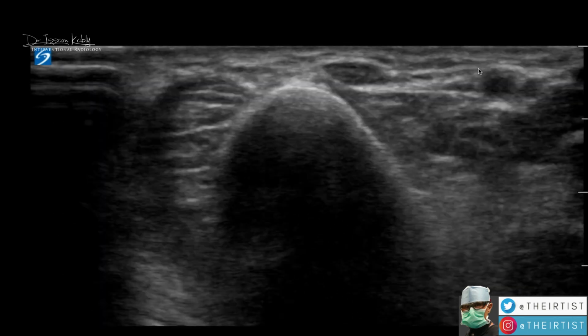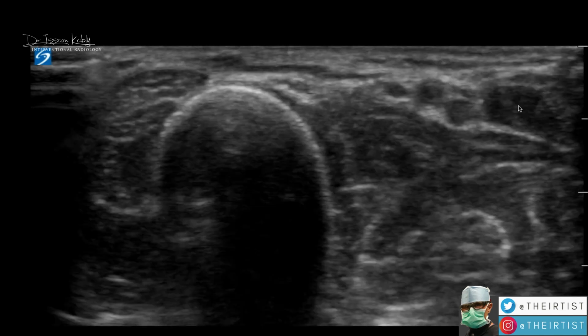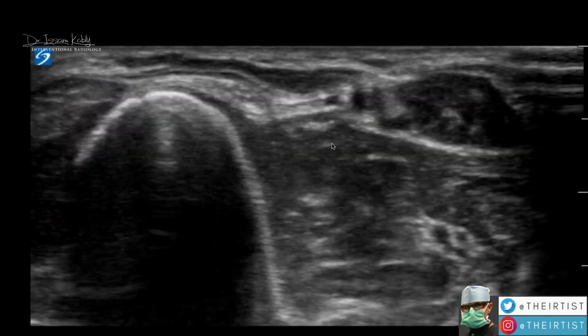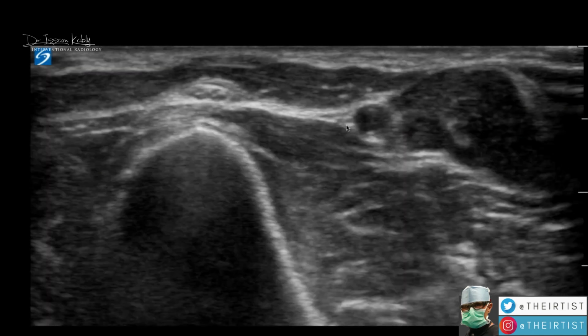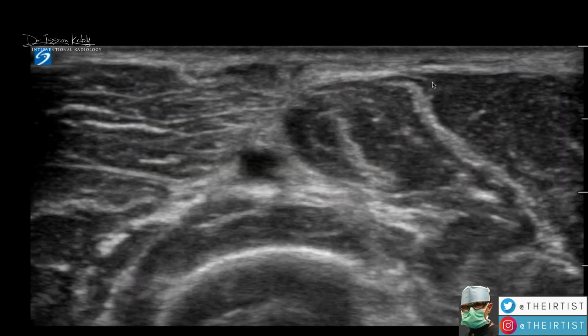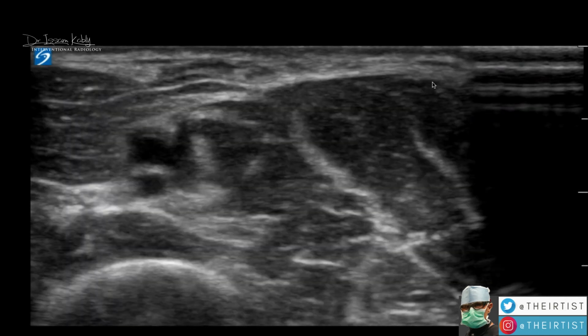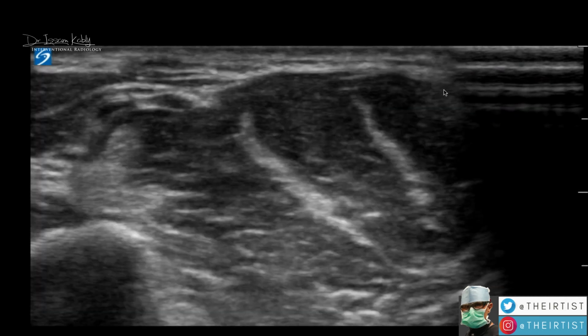Also, you can see the radial artery is extremely superficial. It's literally a few millimeters from the skin. You can palpate it with your finger. It is traveling above a bone, so it is very easy to obtain hemostasis, meaning compression, and stop the bleeding at the end of the procedure. All we have to do is put a wristband on the patient.